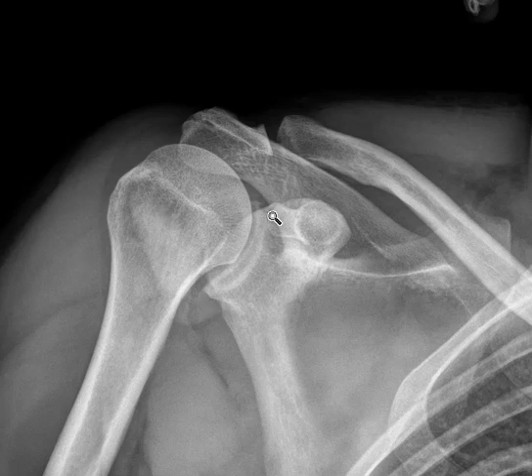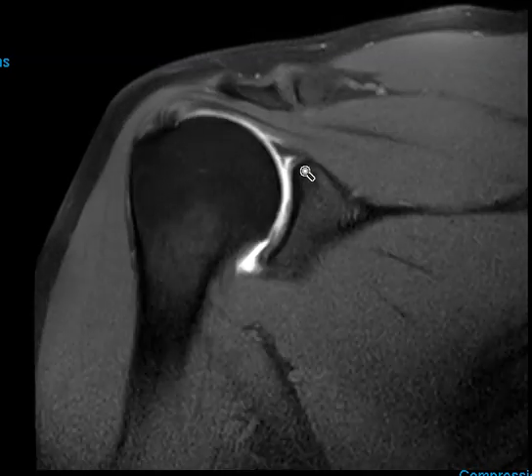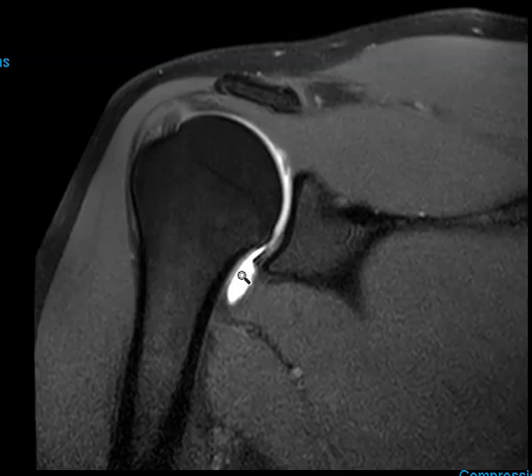Usually the contrast flows in very easily and patients experience no pain at all when we inject. This is the contrast down here, and then we send them on to the MRI scan. On the MRI scan we'll see the contrast show up as white on a T1-weighted view — white contrast in the joint.